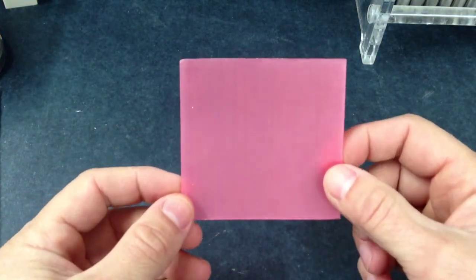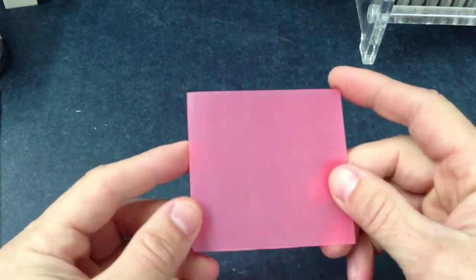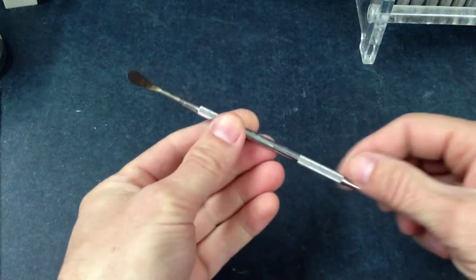Base plate wax to block out undercuts, and a number seven wax spatula for use with the base plate wax.